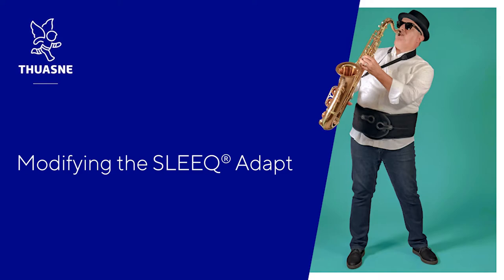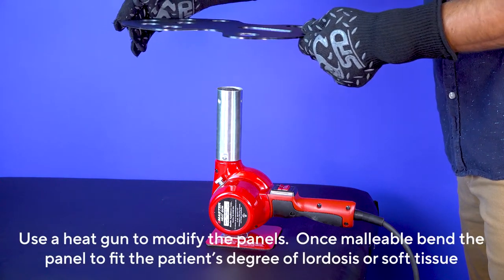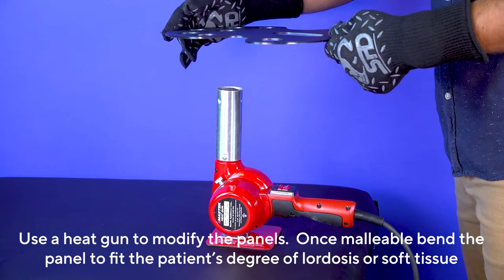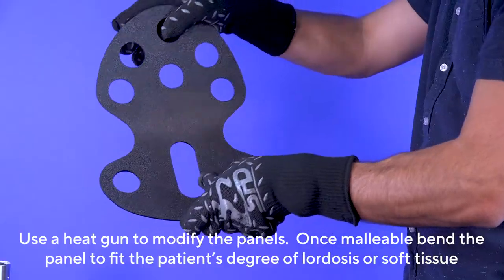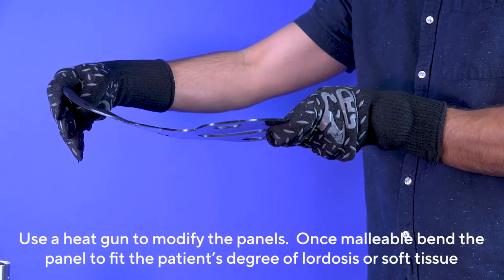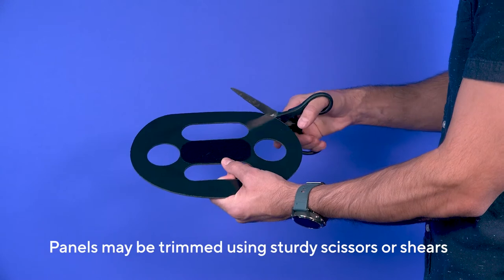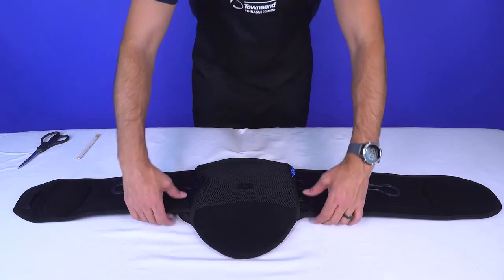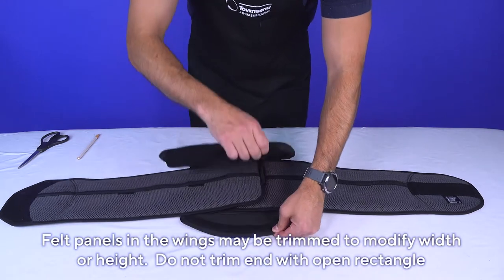Modifying the Sleek Adapt: The plastic panels included may be modified. Use a heat gun, and once malleable, bend the panel to fit the patient's degree of lordosis or accommodate soft tissue. Each plastic panel may be trimmed using sturdy scissors or shears.